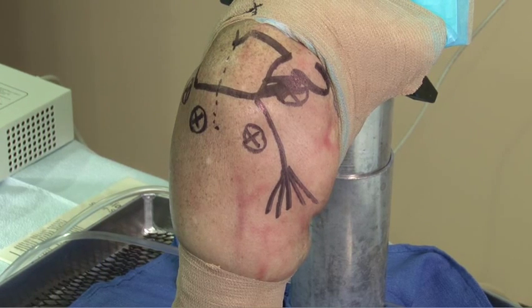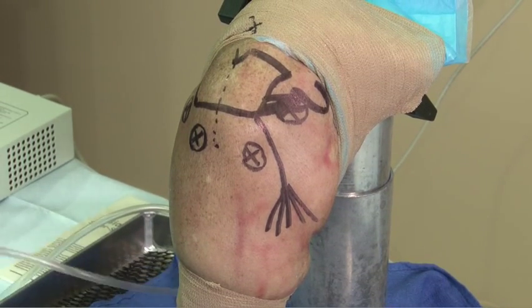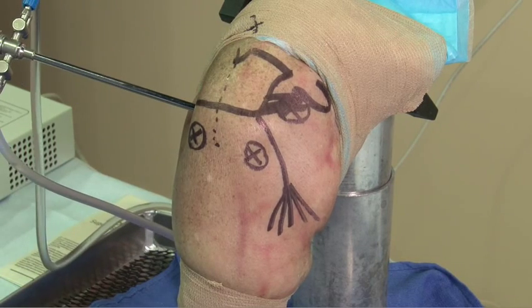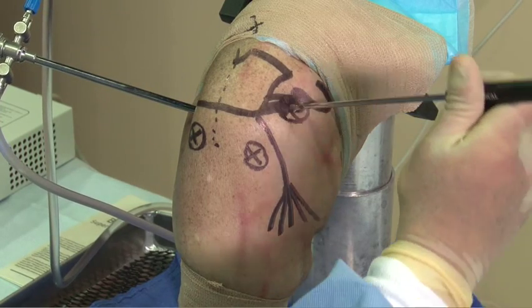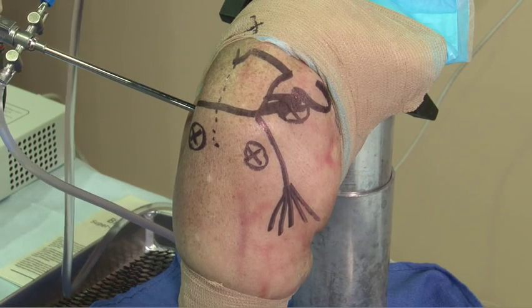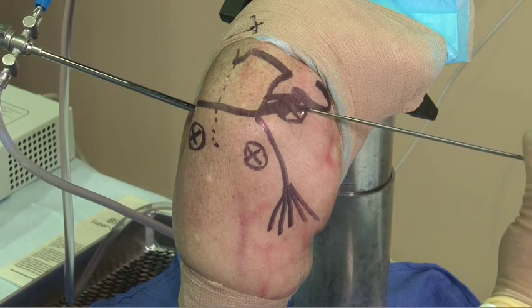When we utilize instrumentation for instability repair, we place the arthroscope generally through a posterior portal when we're performing anterior surgery. We instrument the labrum working through our anterior portal, and we stitch the labrum also working through the anterior portal.